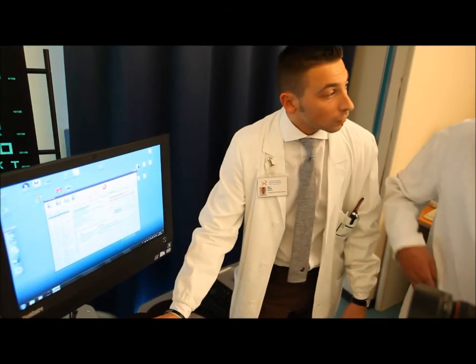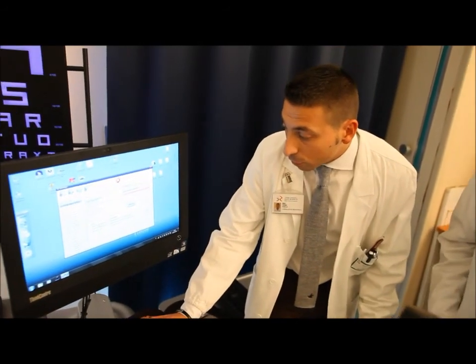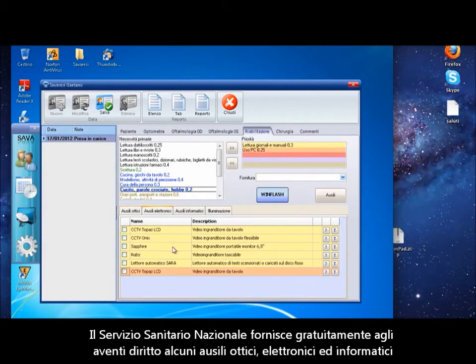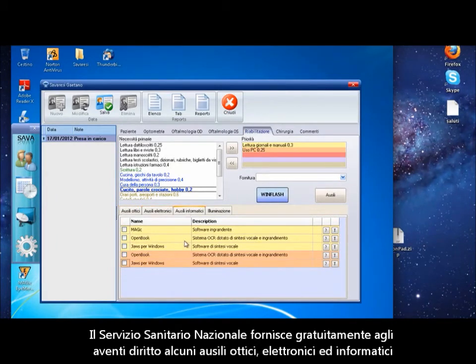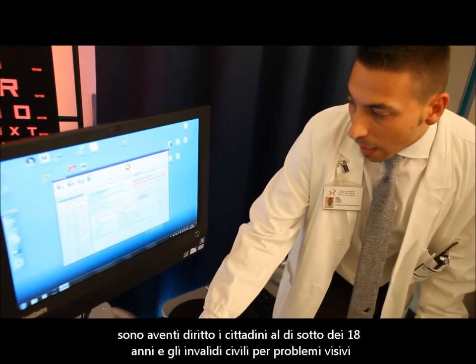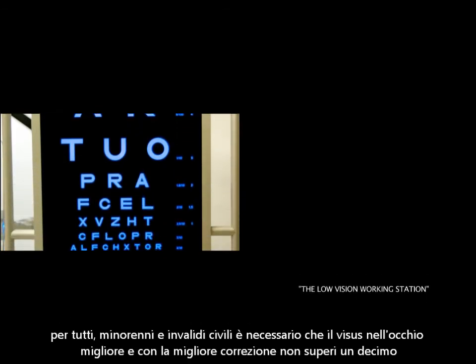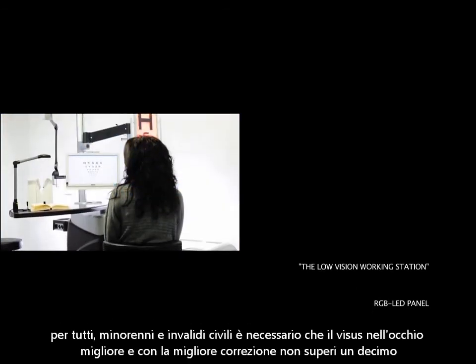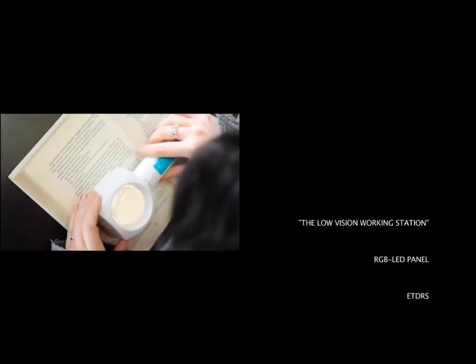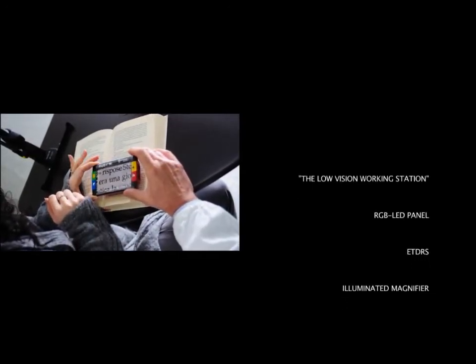The SAVA software, available in Italian, English, Spanish, German, and Portuguese with low vision and visual rehabilitation, may, if authorized, be made available to all centers that use this method for direct and immediate feedback. If the SAVA software is the brain of the low vision workstation, then the auxiliaries installed are certainly the right hand on which a professional can rely for the success of a comprehensive rehabilitation program.